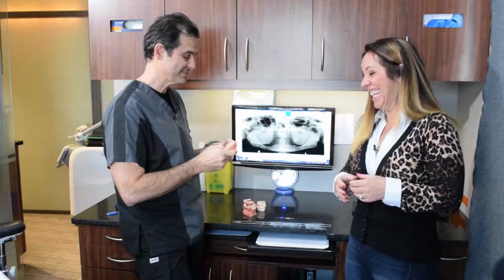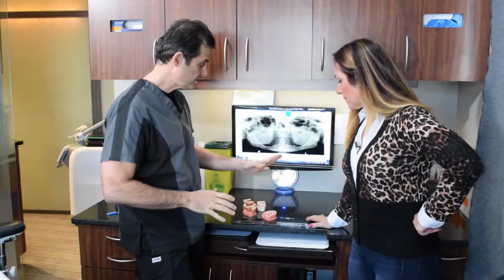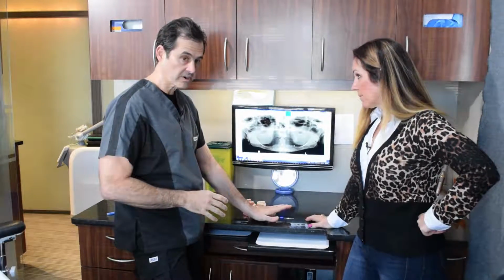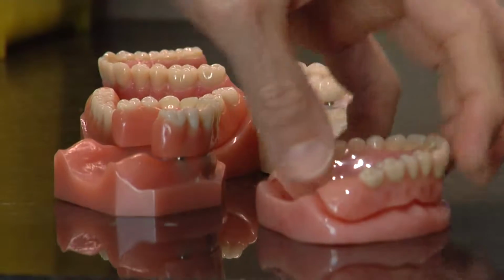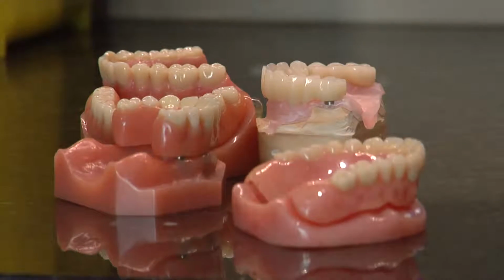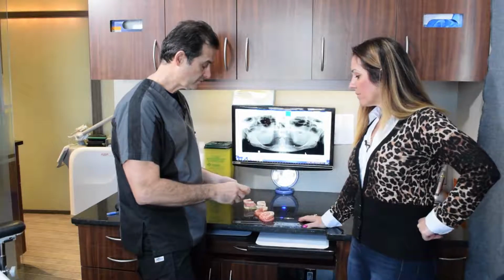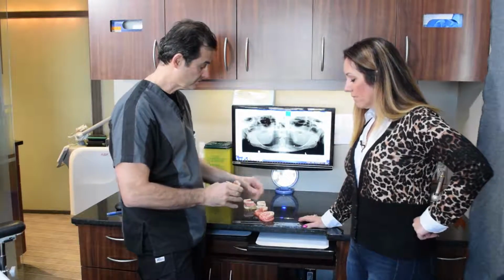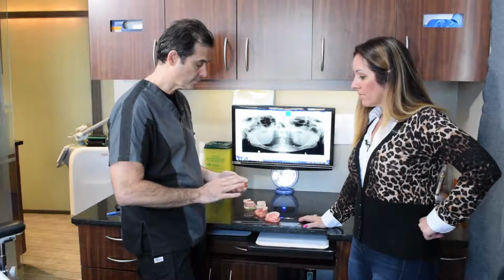That's right, yeah. So what we do have is we have different options that people can do to either get rid of their dentures completely, or to have some kind of denture that's attached to implants, which gives it much more stability. All right. So, as far as replacement options for people who've lost all their teeth, there are a number of things. So obviously we have dentures. So we have a denture that's just on its own. Then we have a denture that's supported by implants.